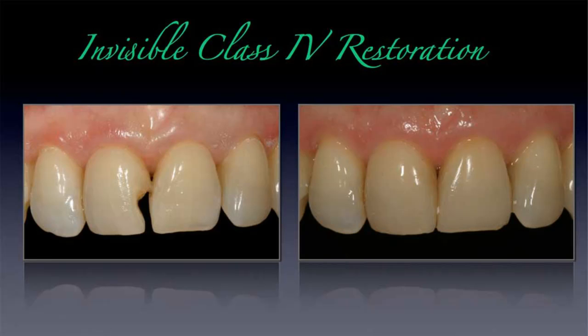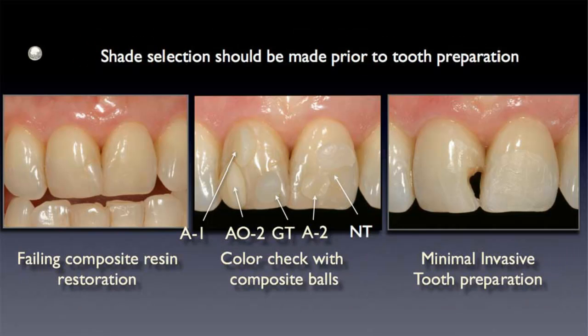So as I mentioned before, prior to doing anything else, I wanted to go ahead and create my menu, or my list of layering, as to which color am I going to use first and second. And so you can see the various shades. As I mentioned, this A02 is very nice, especially when you want to cover this type of show through here.